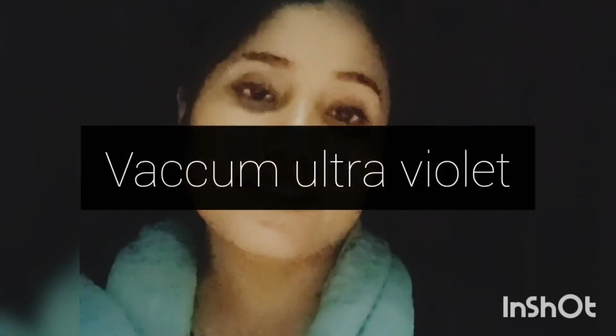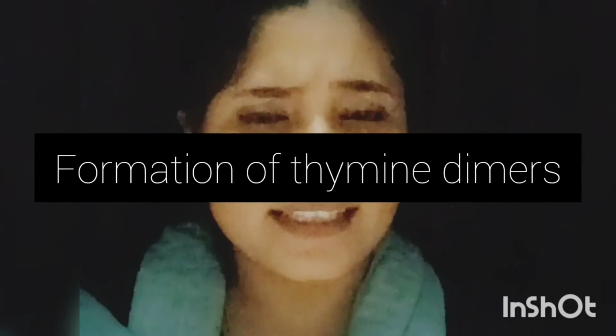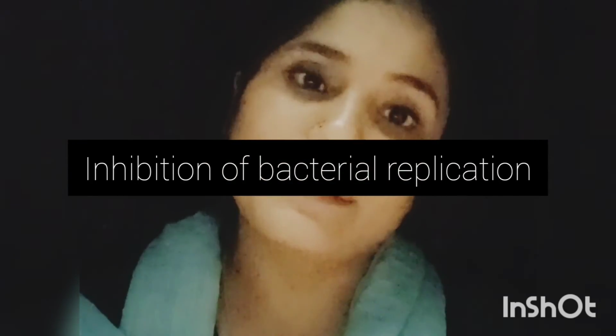I missed a very important topic, that is the mechanism. In this mechanism, UV VUV radiation is a very important step. You might be wondering, I already told what VUV is. VUV means vacuum ultraviolet. In this method, electrons plus ion bombardment plus thermal effects and the production and local exposure of ultraviolet radiation, all this combines to disrupt the cell membrane and the DNA, causing denaturation of proteins and damage to the bacterial DNA. In the bacterial DNA, it forms thymine dimers which inhibit bacterial replication, and base damage, and finally the DNA strand breaks.